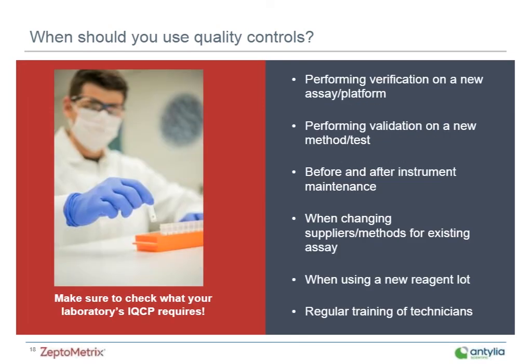So your QC plan really should include considerations like manufacturer's instructions of the test that you're running, the quantity of tests being performed in the lab, and how often reagents need to be ordered, for example. That's just a few of the considerations.